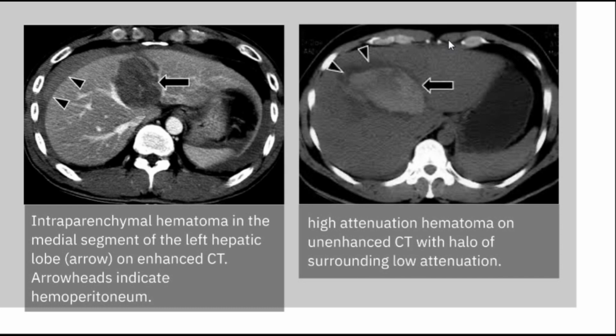And of course, with multiple abdominal injuries, the patient is an emergency. You don't have to wait for urea and creatinine. So you go for native CT first. And when you finish the urea, creatinine, creatinine clearance, the whole workup, then you go for the contrast CT. So probably it will be dense at the beginning.